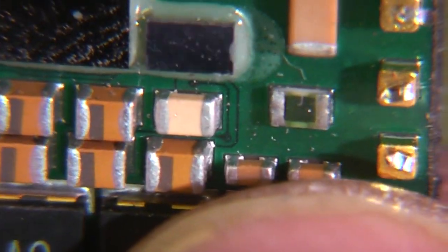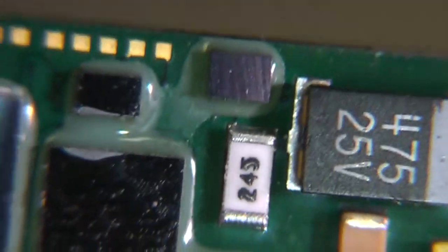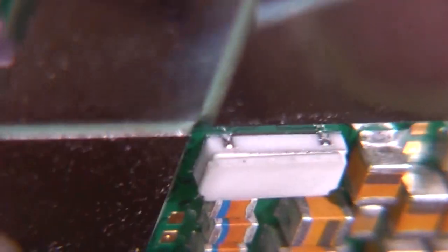I think these might actually be tantalum caps as well because of the markings. There's a few of these resistors which have got these little cuts in them, which are laser trim resistors, so the values are actually trimmed by a laser after they've been assembled onto the PCB. Guessing that's probably a crystal there.